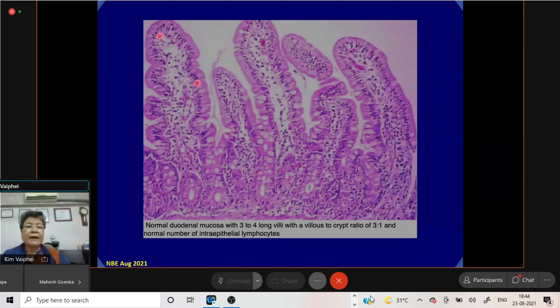And the lamina propria, as when we were talking about the stomach, normally also contains a certain amount of lymphocytes and plasma cells. And so when one is going to talk about the inflammatory condition, ideally one should say whether it is mildly increased, moderately increased, or heavily increased, because normally also one can see a certain amount of them. And so grading possibly is the ideal way of reporting.